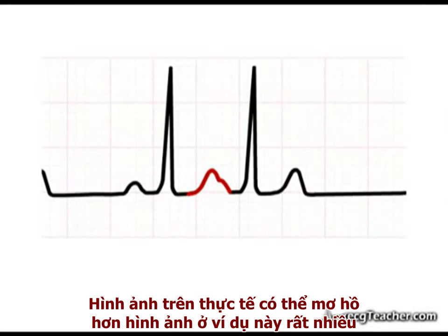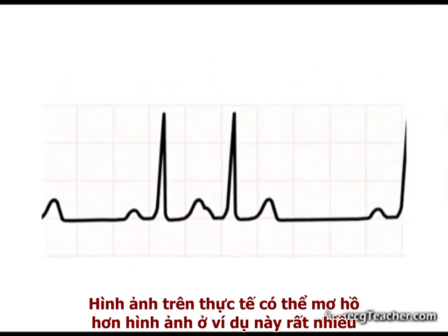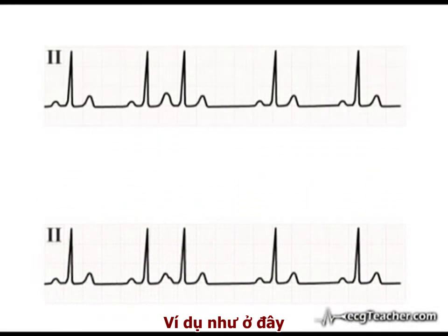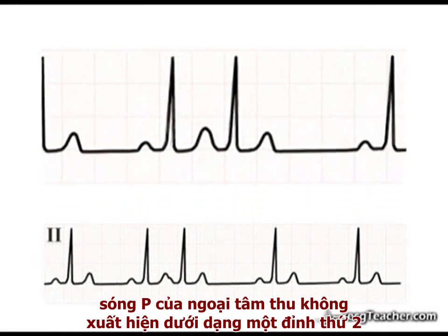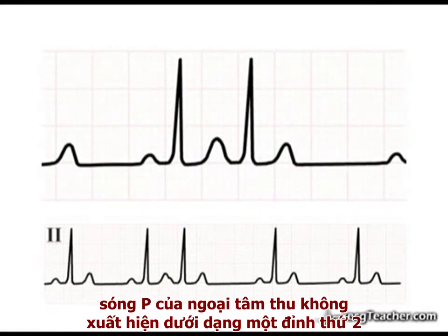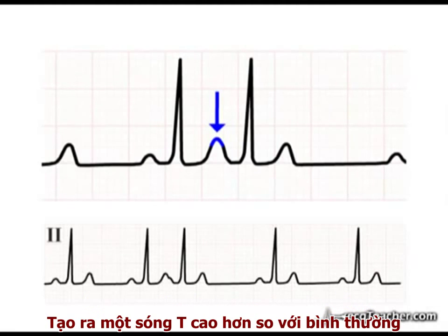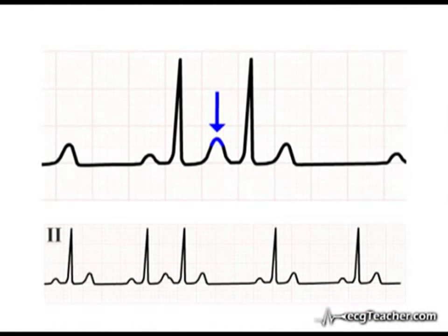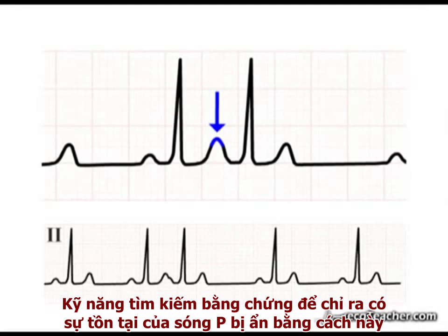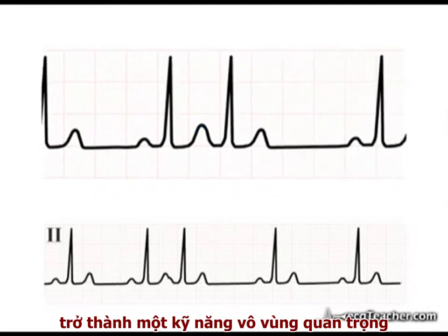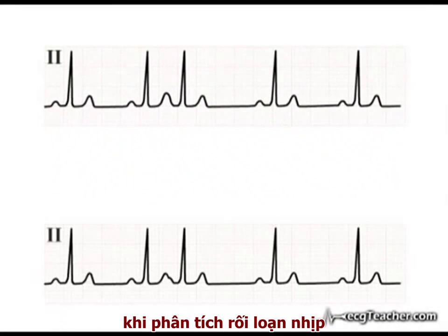The effect can be much more subtle than shown here. In this example, the ectopic P-wave is not visible as a second peak but has merely added to the height of the preceding T-wave deflection, producing a T-wave which is taller than normal. Searching for evidence of hidden P-waves in this way will become a very important skill when analyzing arrhythmias.